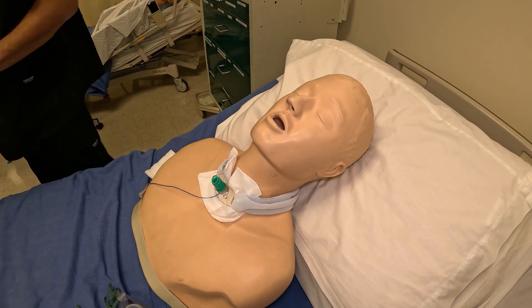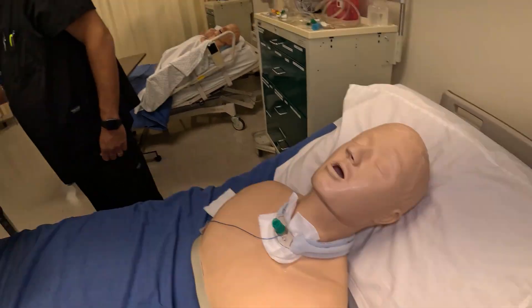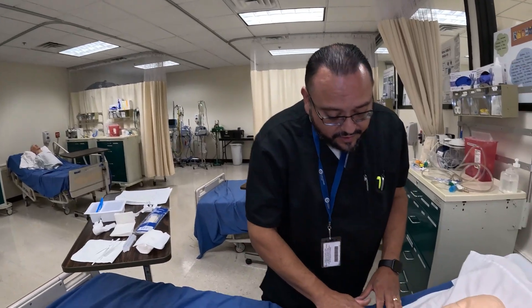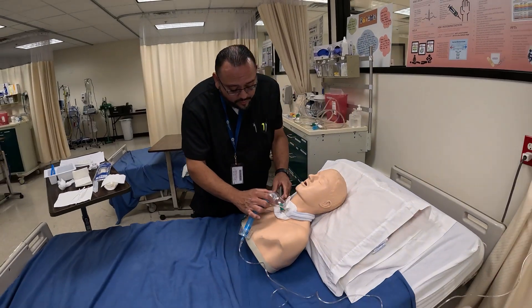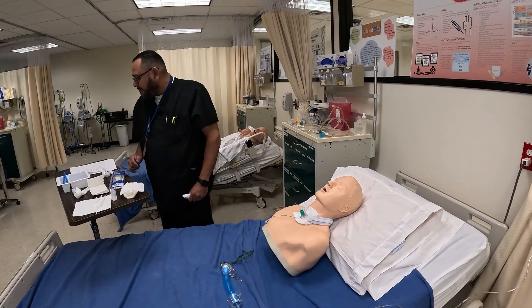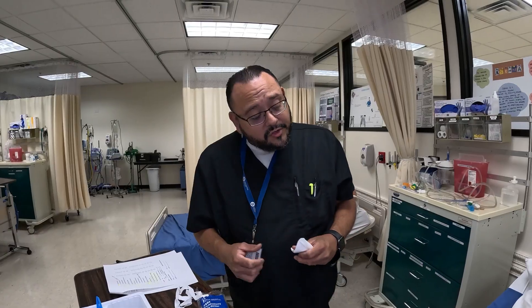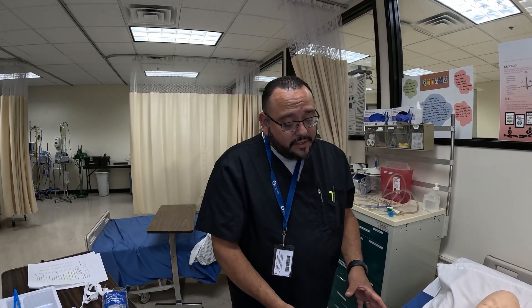After you're done, if the patient needs supplemental oxygen go ahead and provide it. Auscultate the chest to make sure you have good lung sounds, and provide any additional oxygen if needed. Thank the patient, clean up your area, document everything, provide the call light to the patient, and ask if they need anything else before you leave. Make sure they have the call light and know how to operate it.